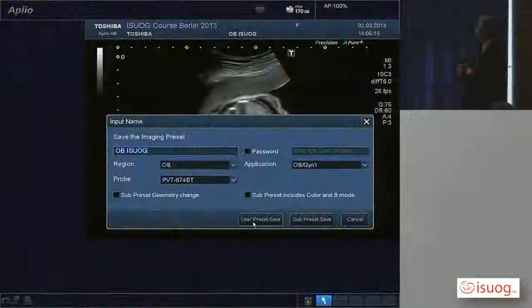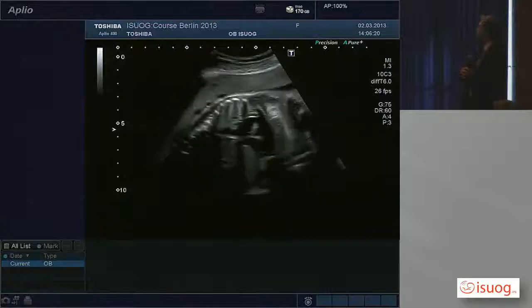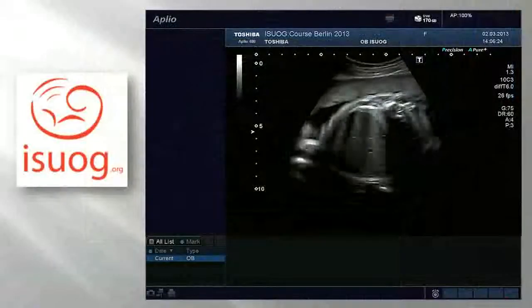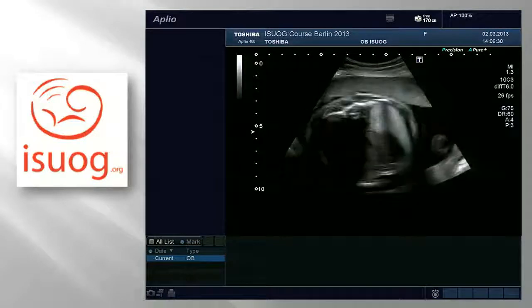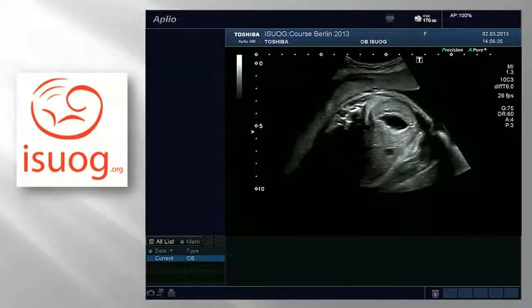So let's see if we are online. Yes. First question, find the heart. Sorry? Yeah.